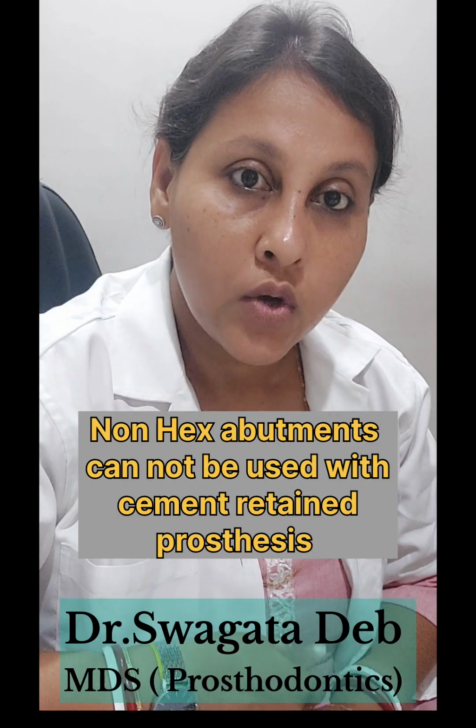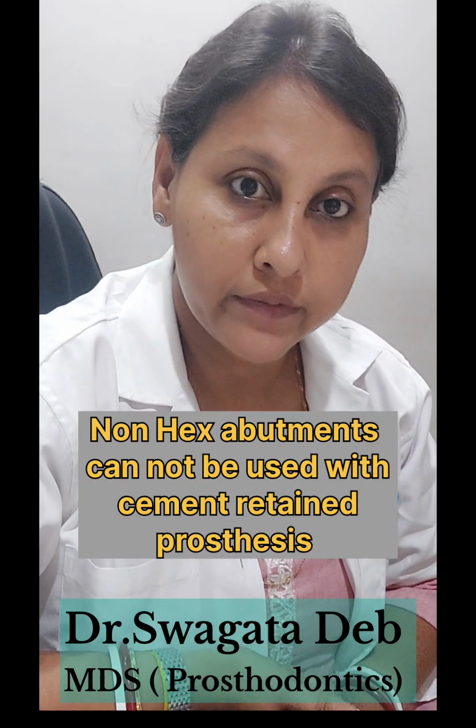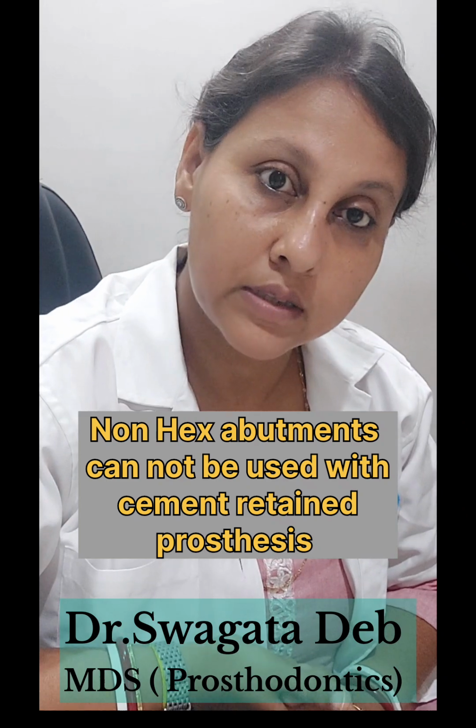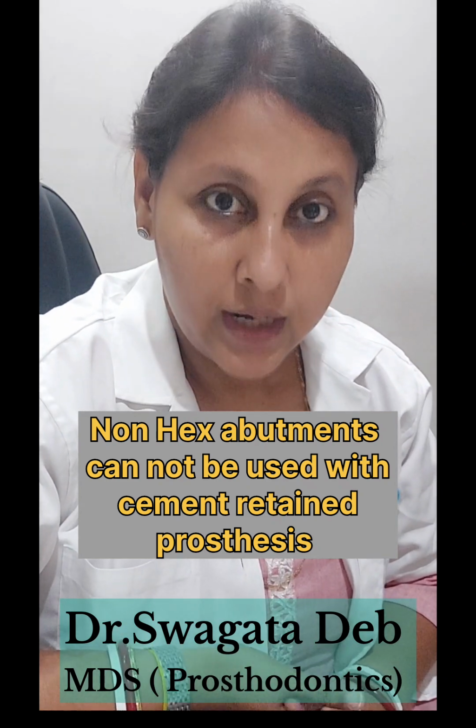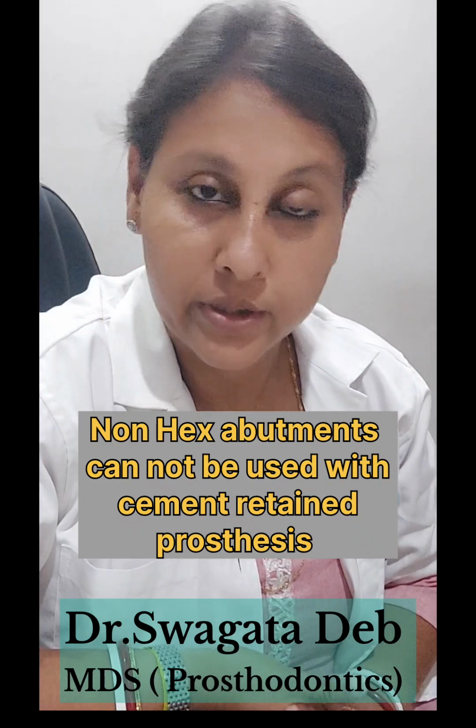Now, non-hexed abutments have certain disadvantages. Since non-hex abutments don't have any retentive surfaces, we cannot use them where we are planning to give the patient a cemented restoration, like in the case of a 3-unit implant-supported bridge.